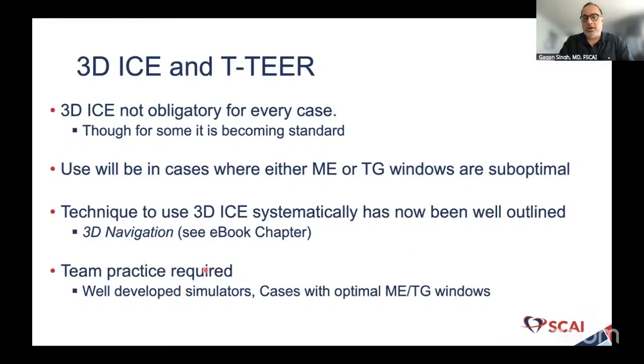And this requires practice. All the manufacturers have done a remarkable job developing very high quality simulators where you can practice these things. So please do so. And of course, try it out in your normal cases where you have excellent mid-esophageal and transgastric windows, and you can try it out as a team. So thank you.